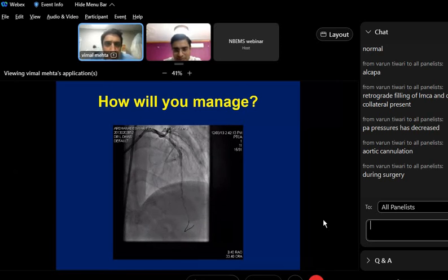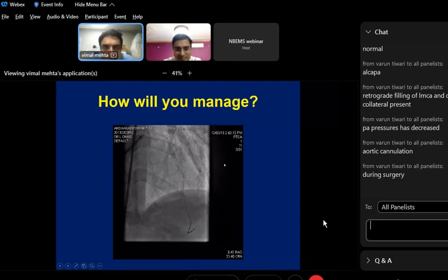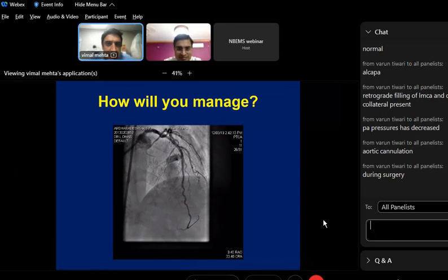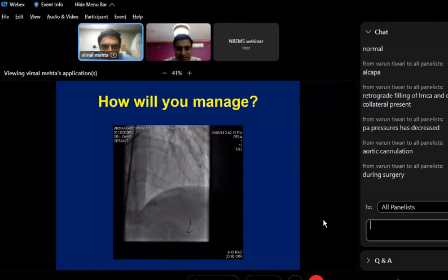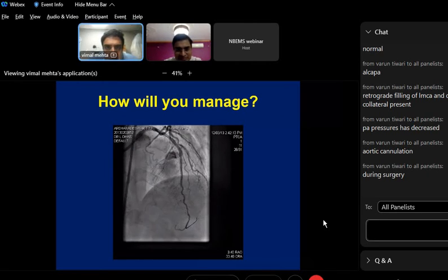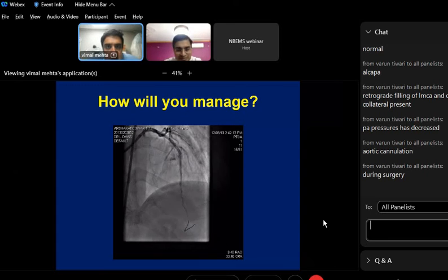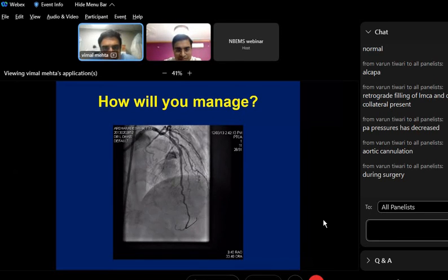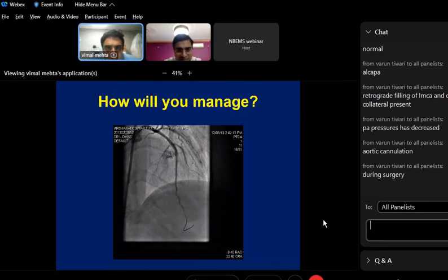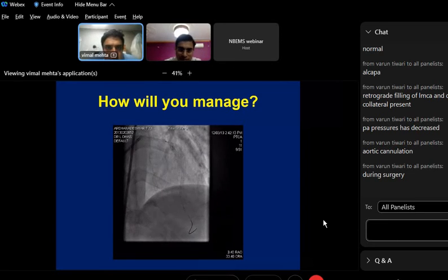Balloon tamponade, very good. So the balloon is already there. Balloon tamponade was done. And if you see carefully, I agree this is not very well seen, this is post-stenting. Just to reiterate what was stated earlier many times by other speakers, and by myself in one of the talks on coronary perforation: by some grace of God, if coronary perforations, even this large, occur after post-dilatation, many of them, not all, resolve by just reversing the anticoagulation with protamine and conservative management.